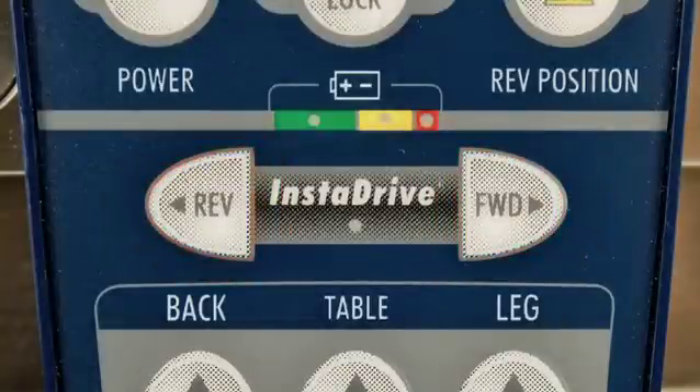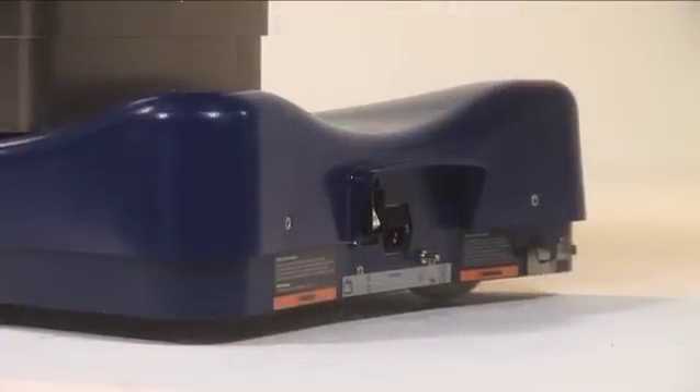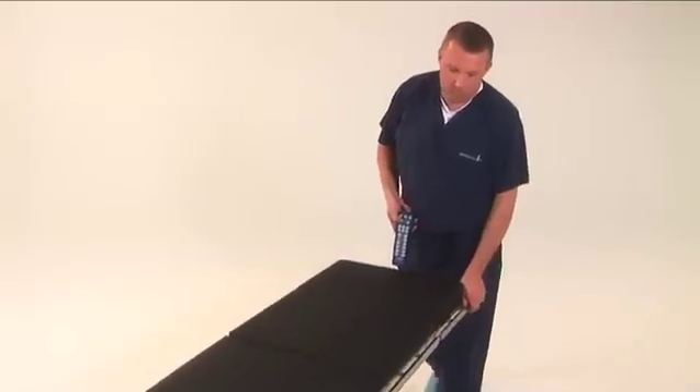Using the forward or reverse key, press and hold the button. The drive wheel will lower and begin moving the table in the desired direction. To steer the table, hold the side rail as the motor powers the table forward or backward.